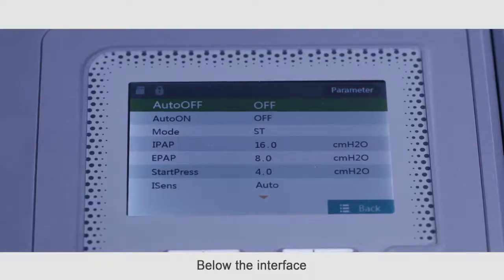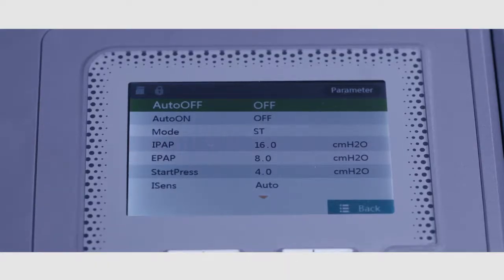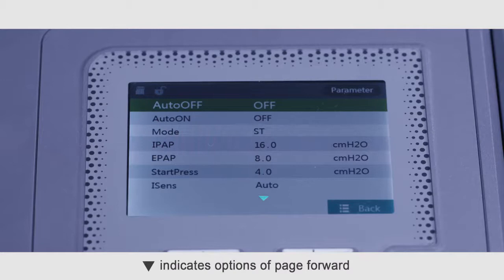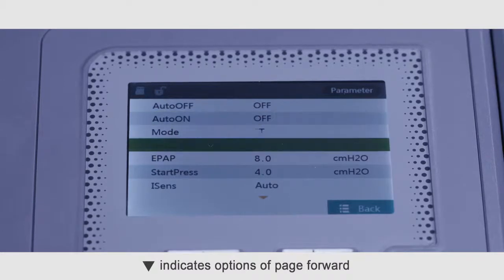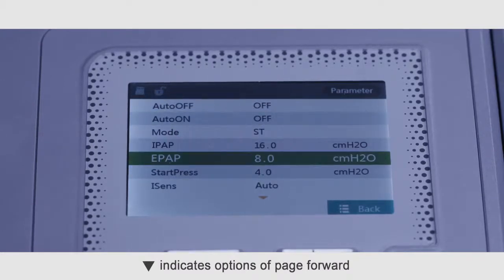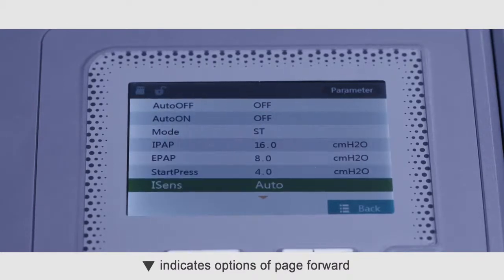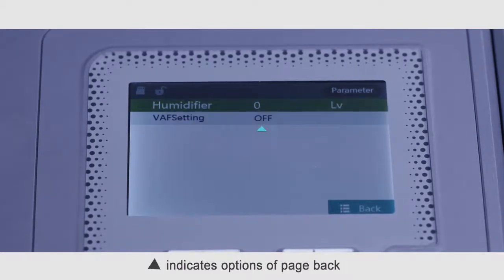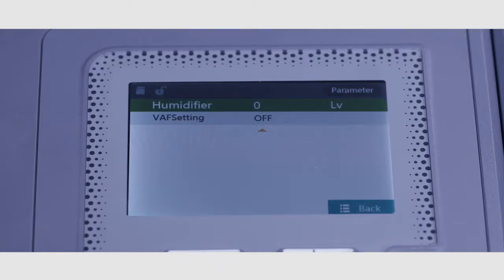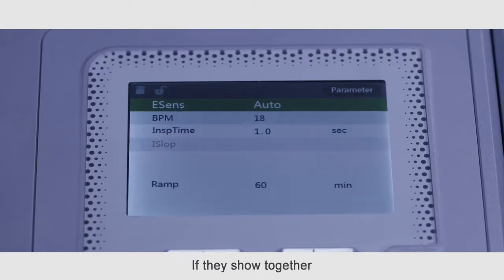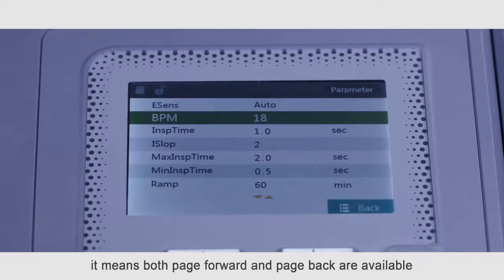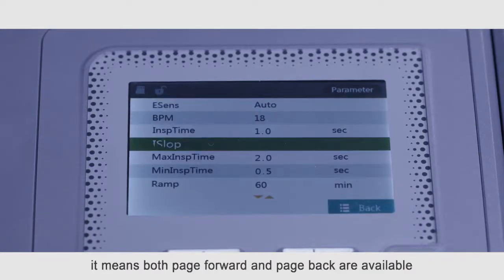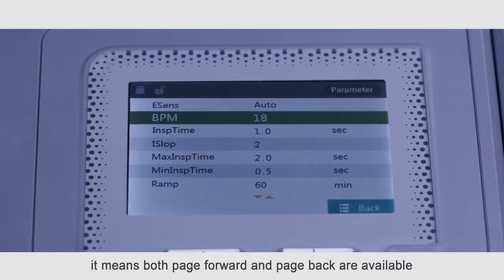Below the interface, down arrow indicates options of page forward. Up arrow indicates options of page back. If they show together, it means both page forward and page back are available.